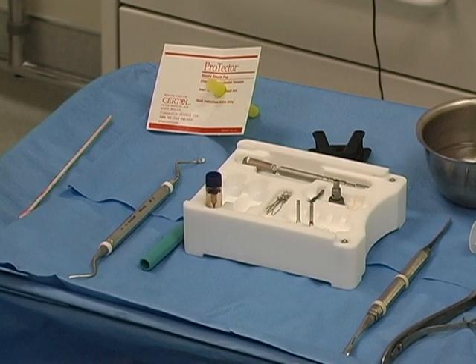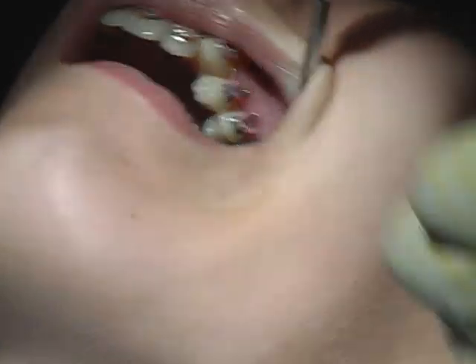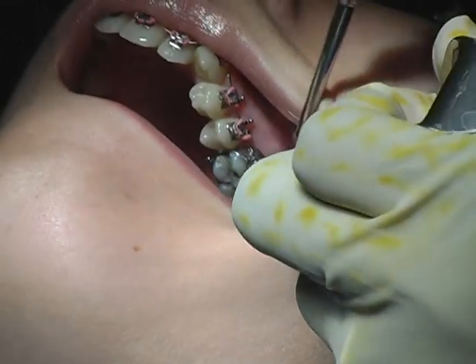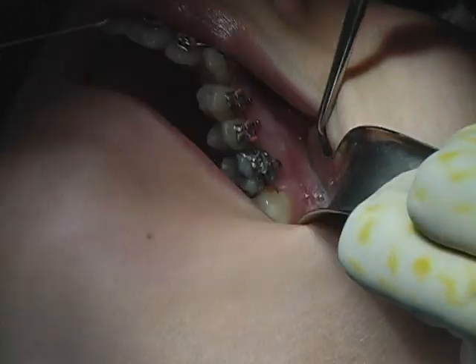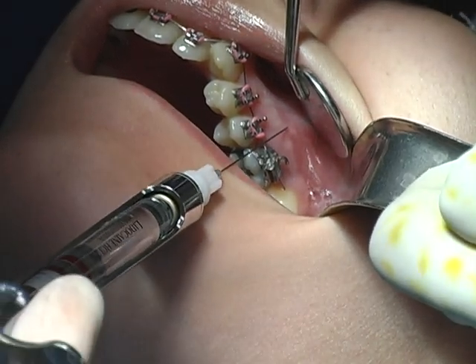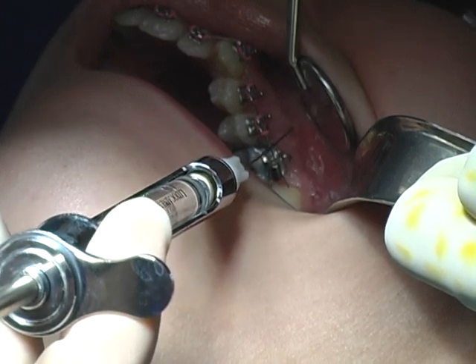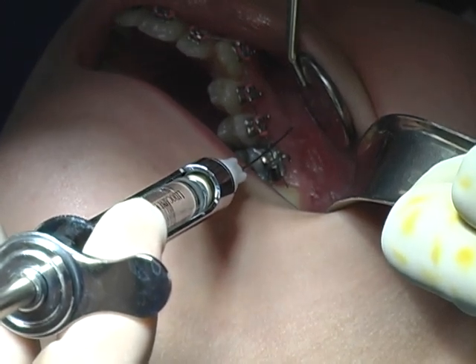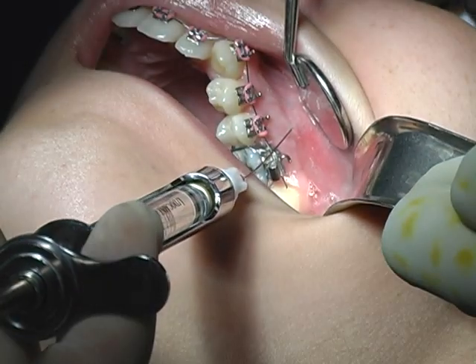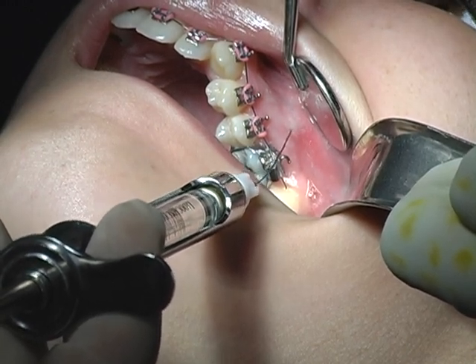We would like to place the pin between the 2nd bicuspid and 1st molar. It starts with the anesthesia at the border between attached gingiva and mucosa. We just place a small depot there.